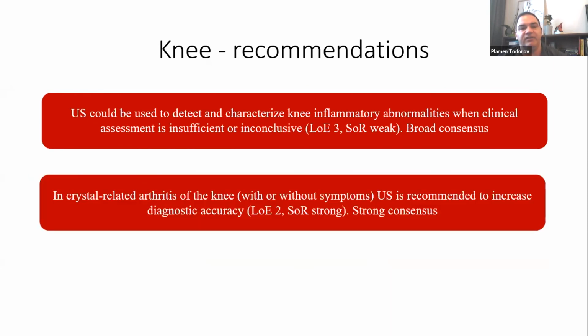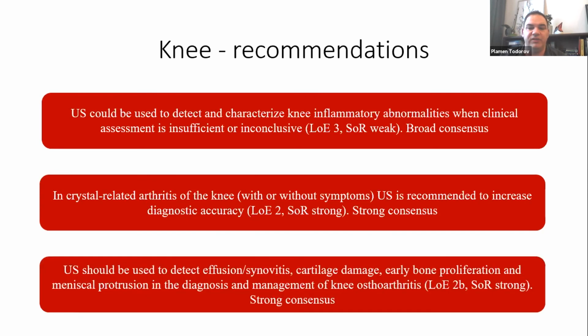In crystal-related arthritis of the knee, with or without symptoms, like in CPPD or gout, ultrasound is recommended for its high diagnostic accuracy. The level of evidence is 2, and the strength of recommendation is strong, and also the consensus by the authors was strong for this recommendation.